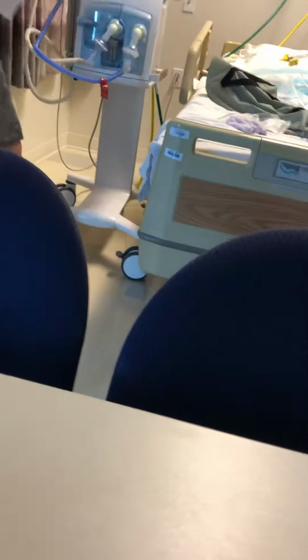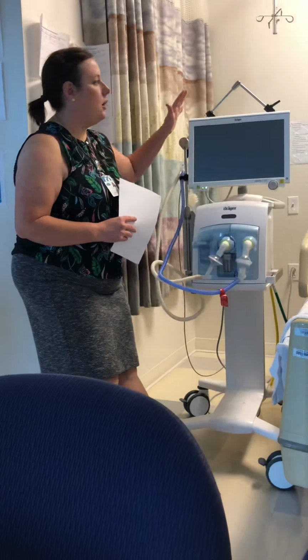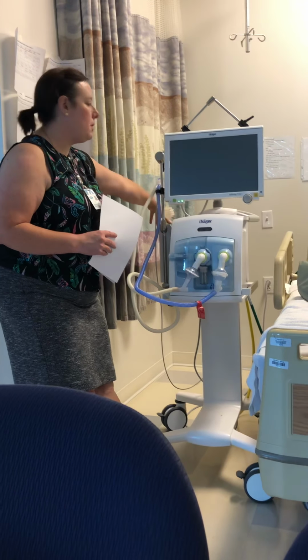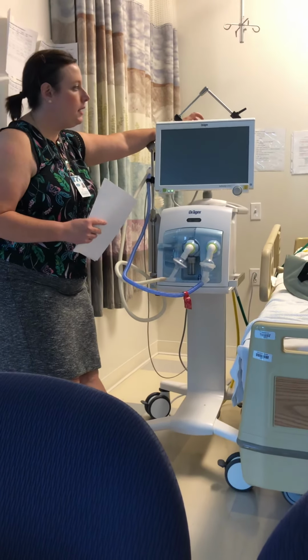So this is the only ventilator that we have that has Neo software. This is the vent that the vent returns will be on, okay? You'll get it from 0, so you'll have to plug it into the high pressure air and oxygen outlets. You should always plug it in, obviously. In a hospital setting, it should be plugged into a red outlet.